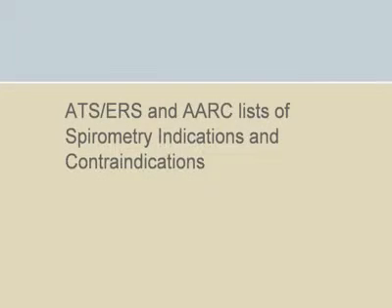The ATS, ERS, and AARC have published comprehensive lists to assist technologists in identifying indications and contraindications. It is important to have thorough knowledge and understanding of these indications and contraindications, and to carefully consider them when gathering patient information during the pre-test phase of spirometry testing.